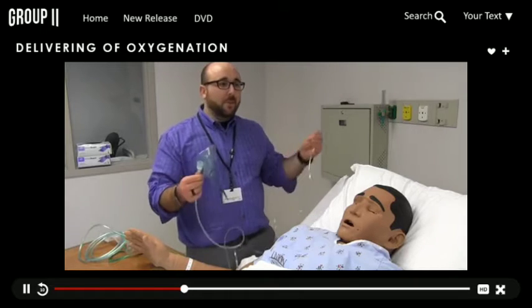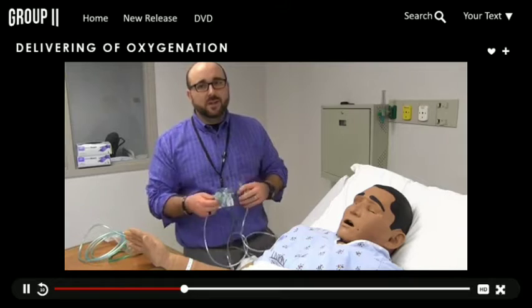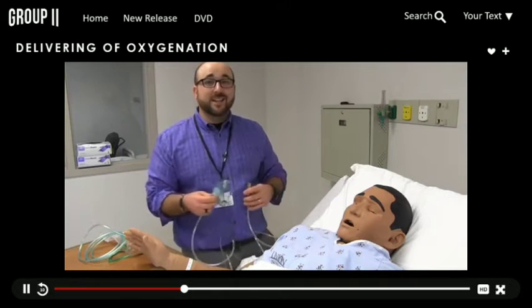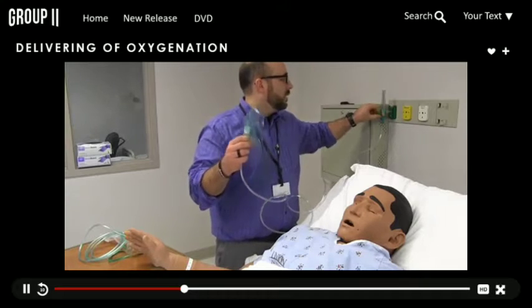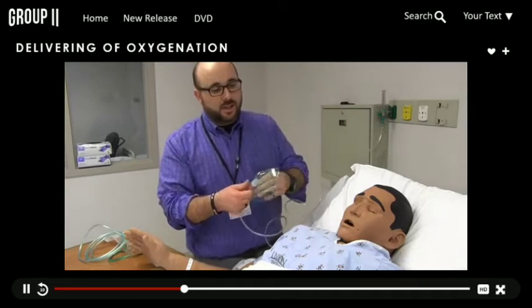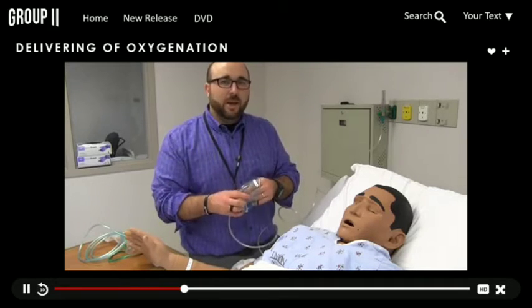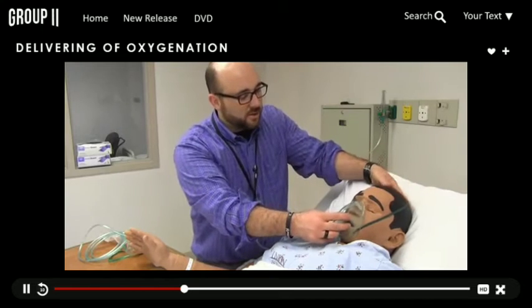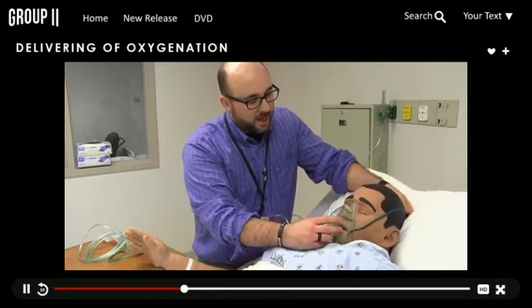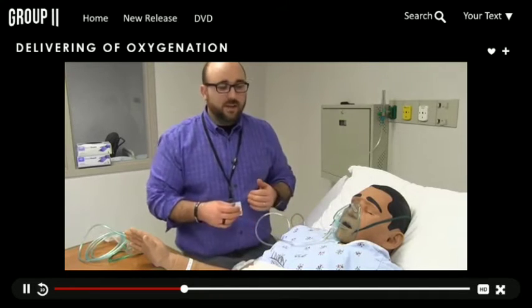So generically, you can put a low flow of oxygen on this if you want, but usually we go anywhere from 8 to 10 liters. So I'll plug this in, go to 8 liters, and you can hear it running. This is what you'll see in some of those other areas. The patients aren't necessarily critical, but we're just going to deliver oxygen. Obviously, it goes over the back of the head here, and this part squeezes down on the nose, and we can give the patient oxygen.